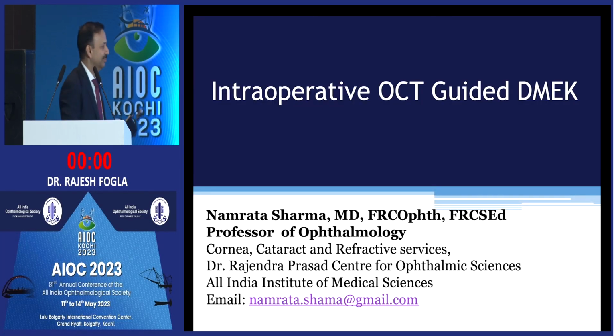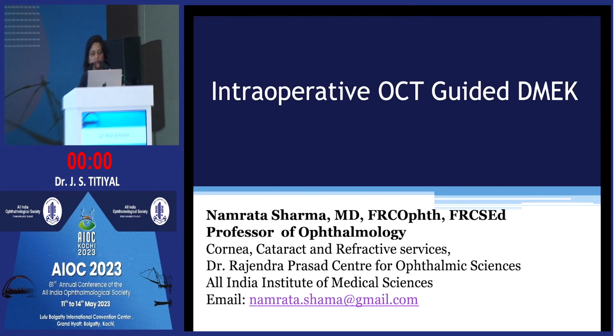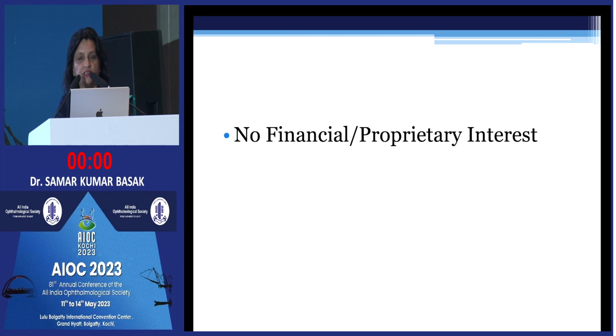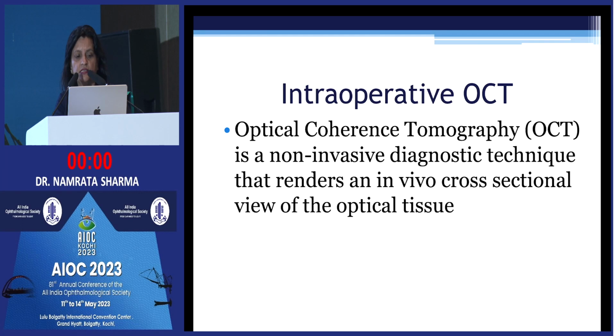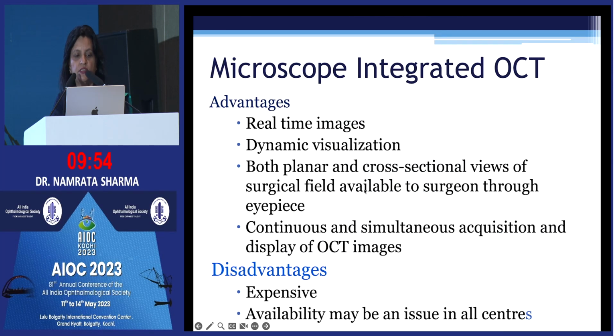Yes, sir. Yes, please. So I would be talking to you about intraoperative OCT guided DMEK, or Descemet membrane endothelial keratoplasty. There are no financial or proprietary interests, and this does have a role to play because it is a non-invasive diagnostic technique that renders an in vivo cross-sectional view of the optical tissue. The one that we have is the microscope integrated OCT, in which you can actually see real-time images and allows a dynamic visualization of both the planar and the cross-sectional views of the surgical field, which is available to the surgeon through the same eyepiece.